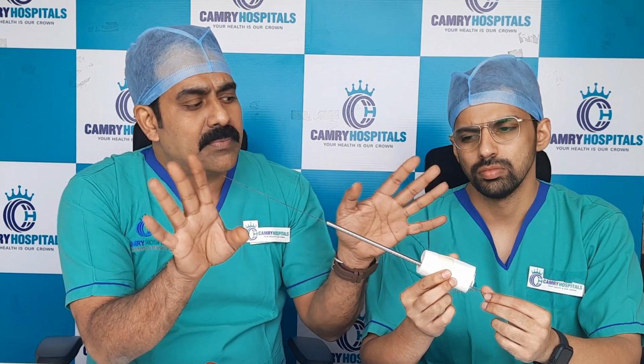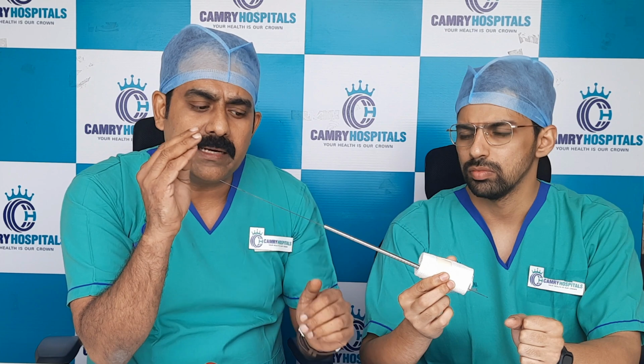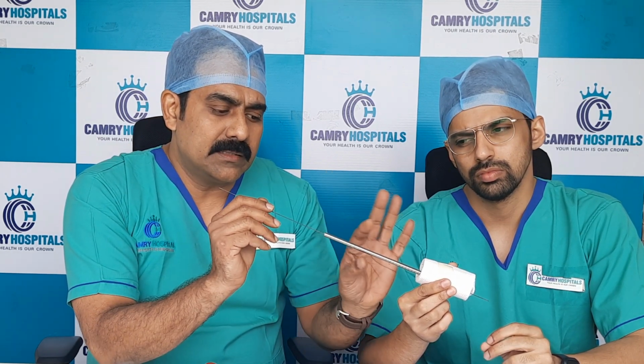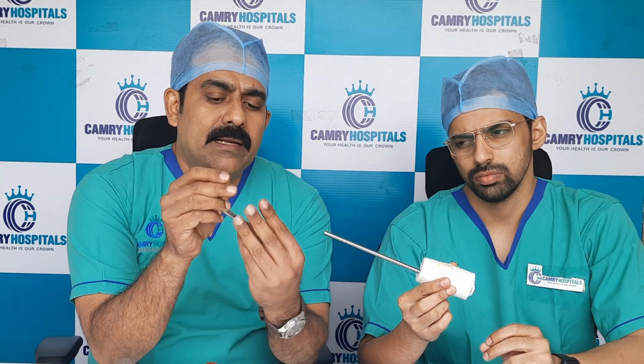All this time the patient is awake. We will talk to the patient, and the patient will tell us if there is pain. We will again give a shot of local injection, and the patient will be under slight monitored anesthesia care. So the patient will be awake, responding to us when we ask if there is pain. So once the dilator is inside we will remove the guide wire. Then there is the dilator of diameter 6.9 mm.